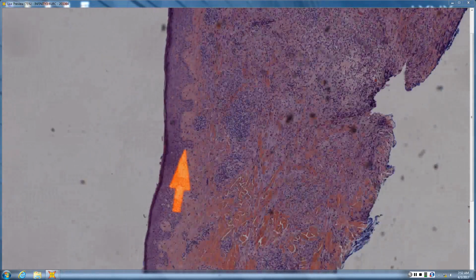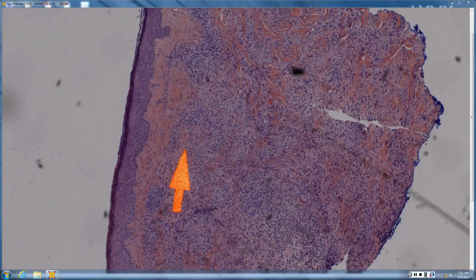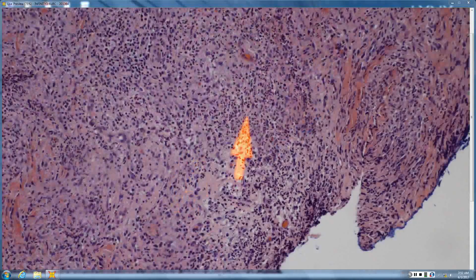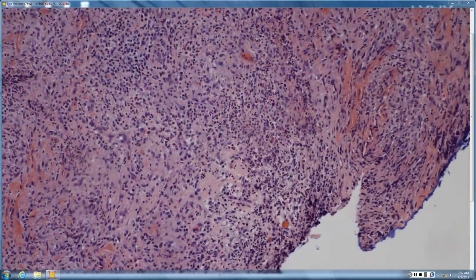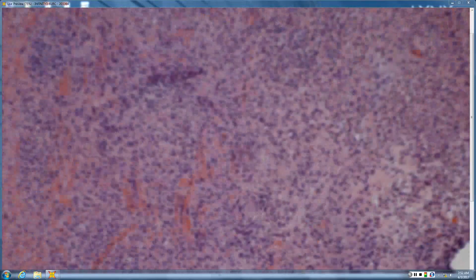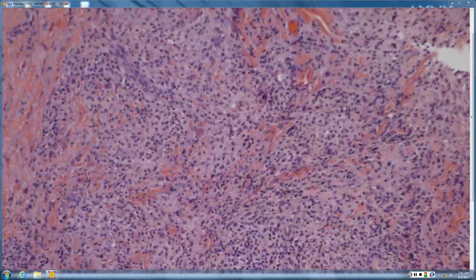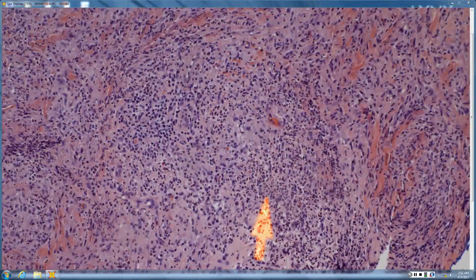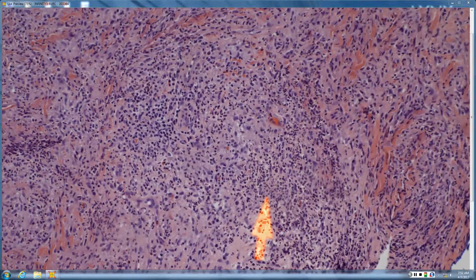So this one has a busy dermis. Some of the cells look more histiocytic, admixed with lymphocytic infiltrate. It's pretty diffuse in one cut. And a lot of karyorrhectic debris, it looks like. So why would there be clusters of neutrophils? And it's not like a pyogenic granuloma where the crust was on the surface. This is down in the heart of the thing. There are all these little clusters of neutrophils down in the middle.